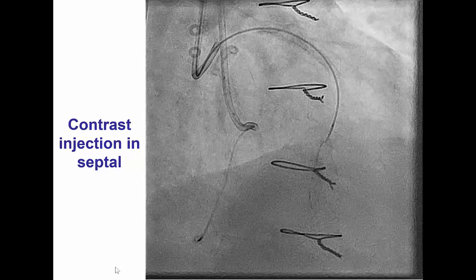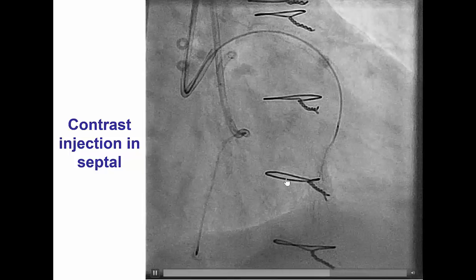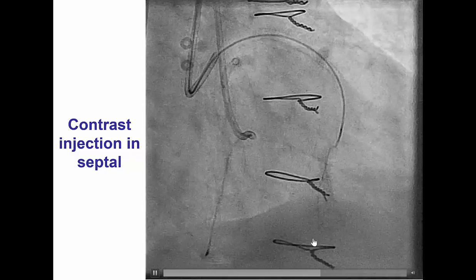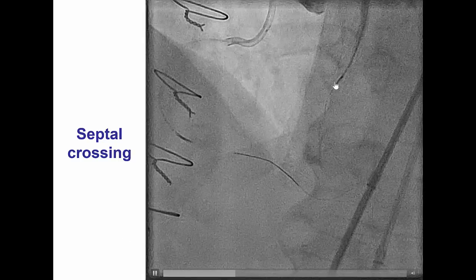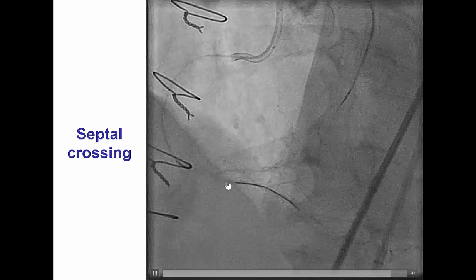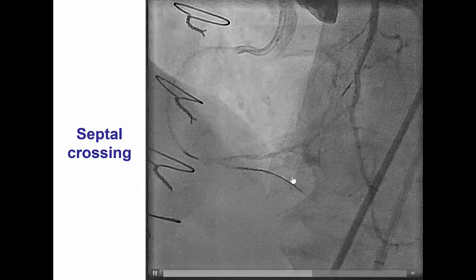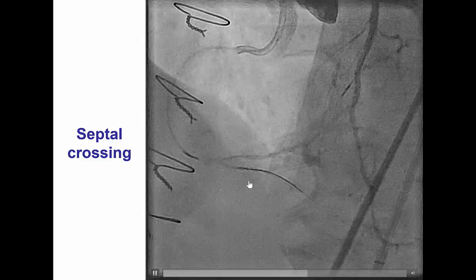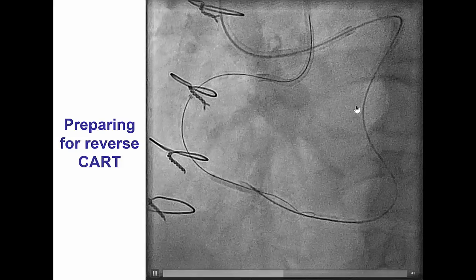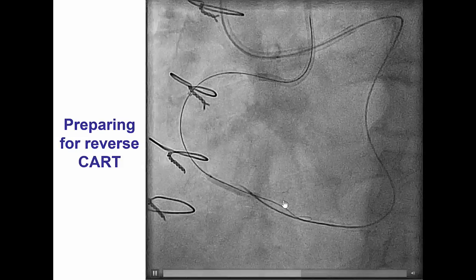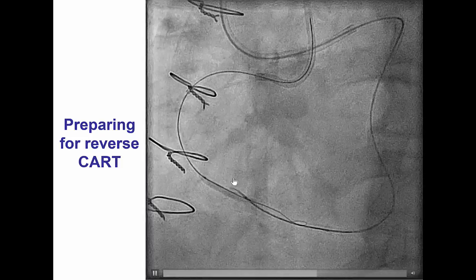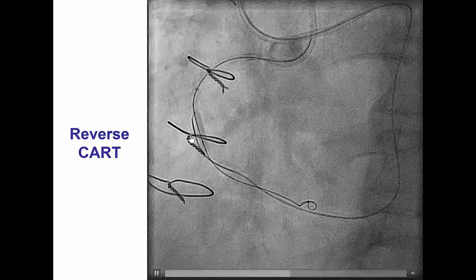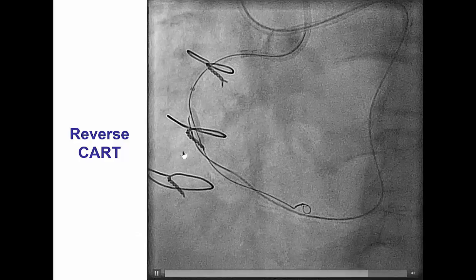Since the collaterals were mainly epicardial, we first performed an injection into the septal showing a connection with the PDA, and we were then able to advance our Corsair, perform a retrograde knuckle, and prepare for reverse CART, which was achieved in the mid part of the right coronary artery.